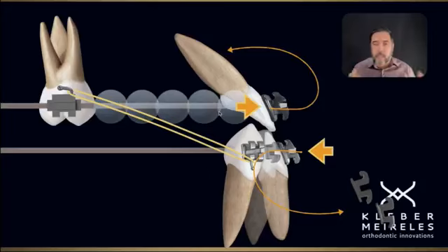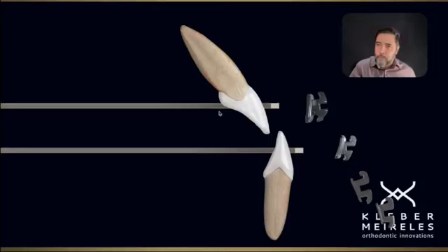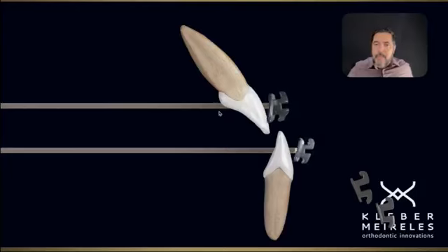There's a bracket that is thought for giving a good mechanics in a sagittal way. So those brackets are different. They are upside down, let's say, almost upside down, because we have now a different torque for upper and a different torque for lower to compensate the moment of the force during the inclination, during the movement, the sagittal correction of anterior teeth. So the same situation here.